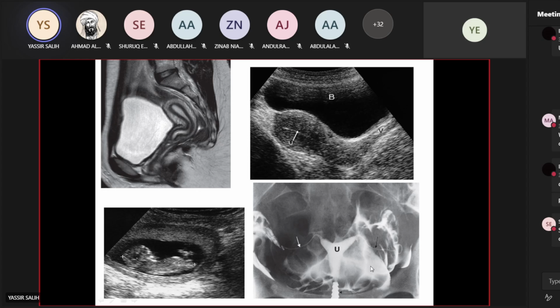This is hysterosalpingography. Hysterosalpingogram or hysterosalpingography. The anatomy: this is a cannula or catheter. They try in the cavity of the uterus. Fallopian tube on both sides, right fallopian and left fallopian tube. All the rest is contrast spill. This is normal.